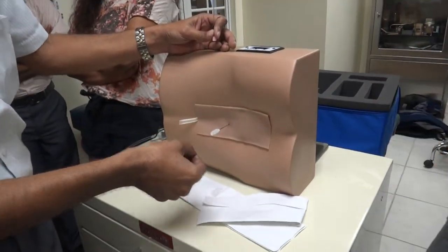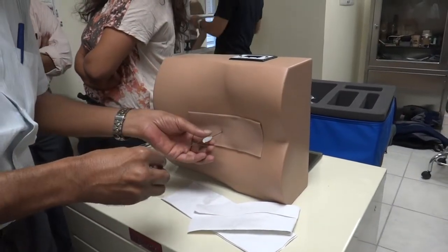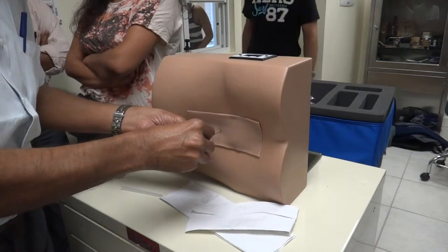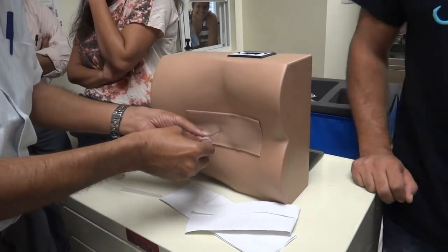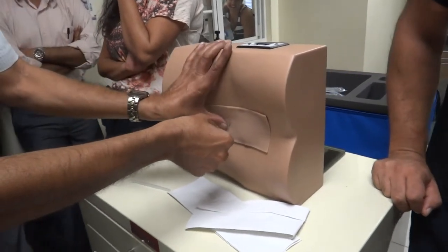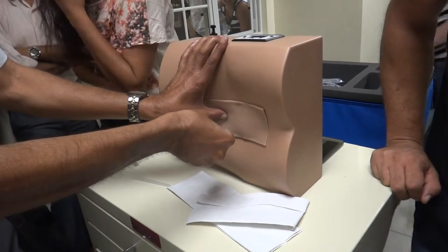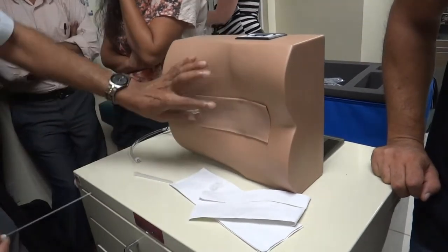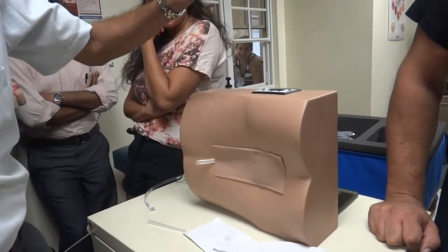You can also take a sample of CSF for diagnostic purposes. After you've done that, reinsert the stylet. And with a little counter pressure here, just pull the thing straight back.